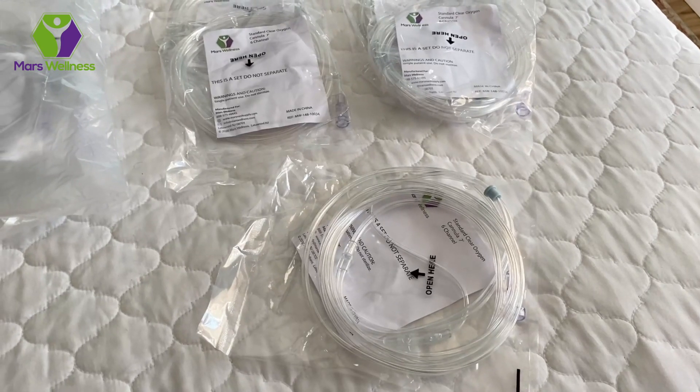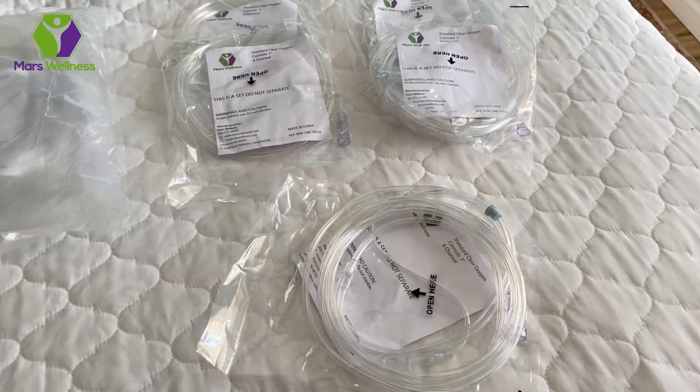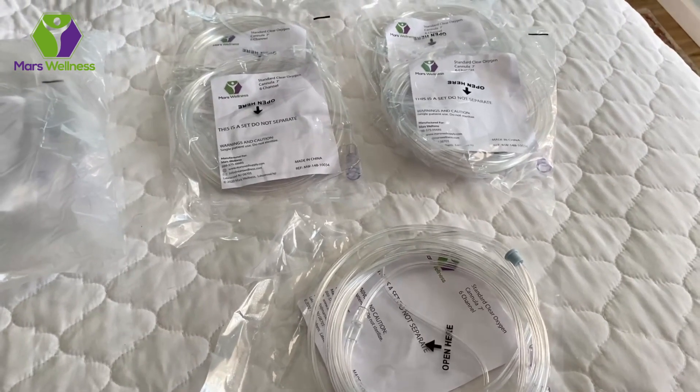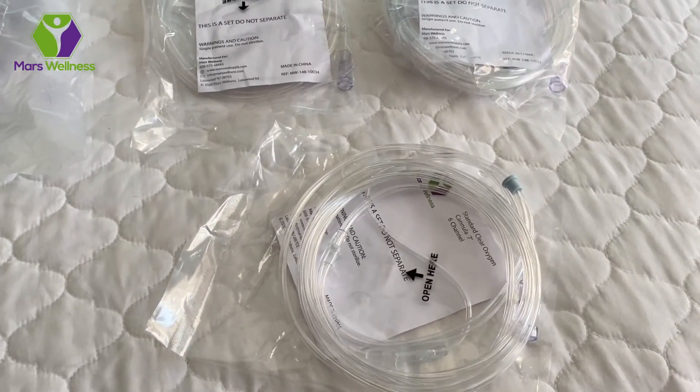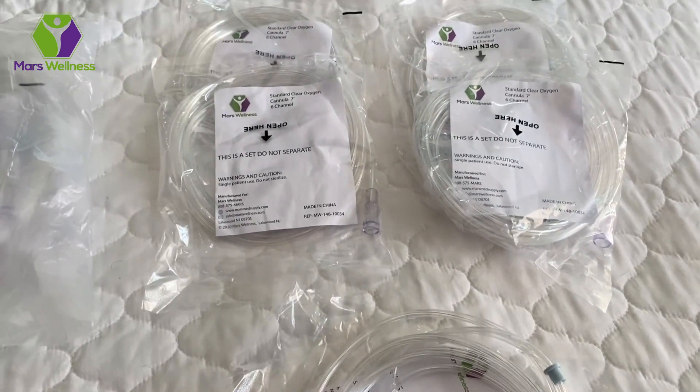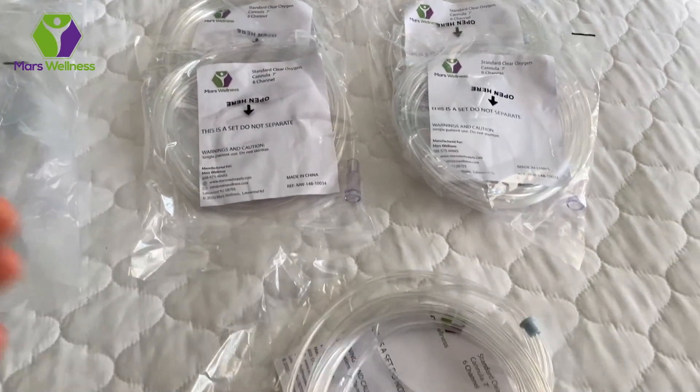This is my review for the 7-foot oxygen nasal cannula. This is a 10-pack. These are used for getting oxygen from an oxygen tank or you can use it for a concentrator. It's a universal fit, so that's good.